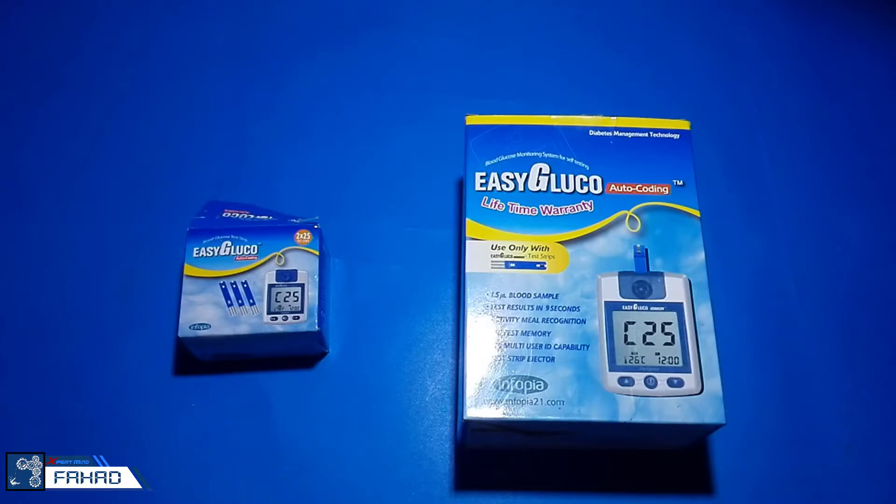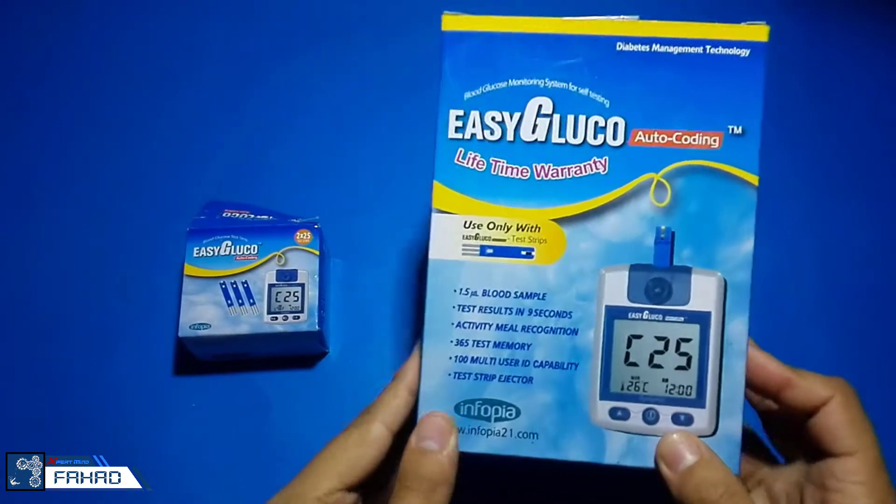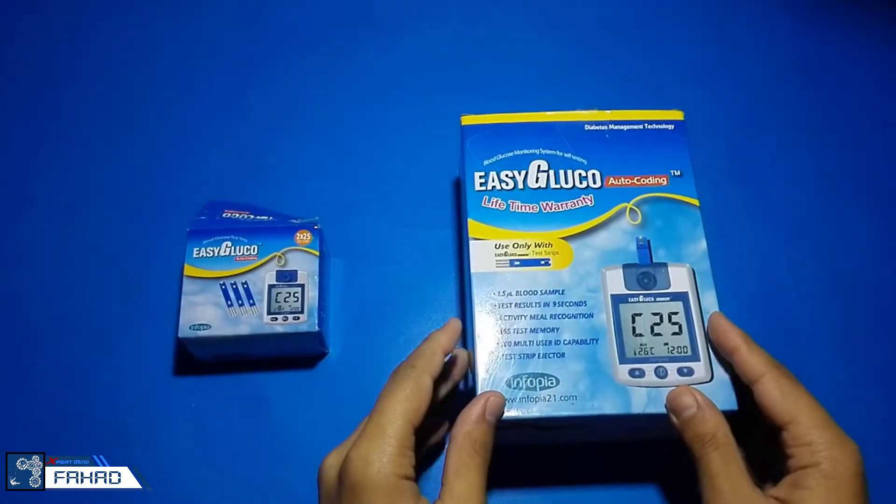Today I got something new to show you and that is a glucose meter. In this video, I will show you what is inside this glucose meter completely from unboxing to screwing it up.